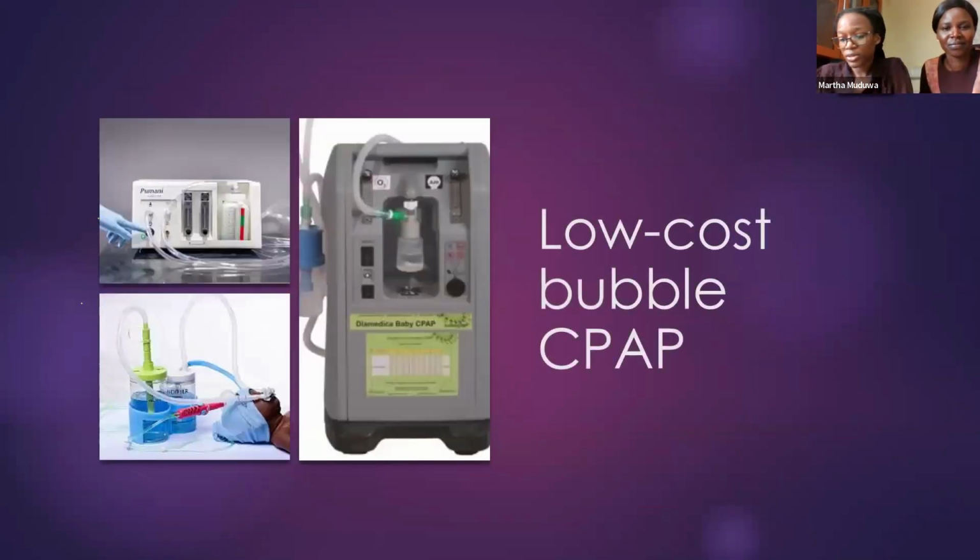So here are some examples of our low-cost CPAPs that are available in our setting. We have the Pumani CPAP, and this runs in a concentrator, so all these need external sources of oxygen.